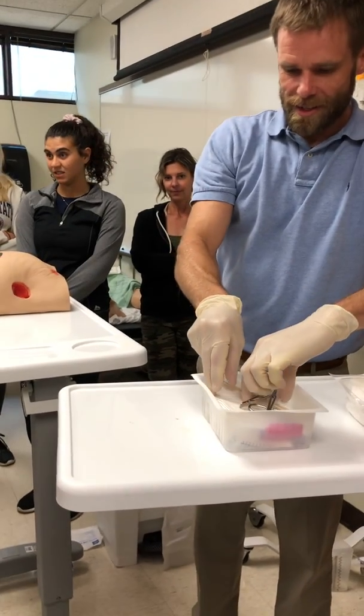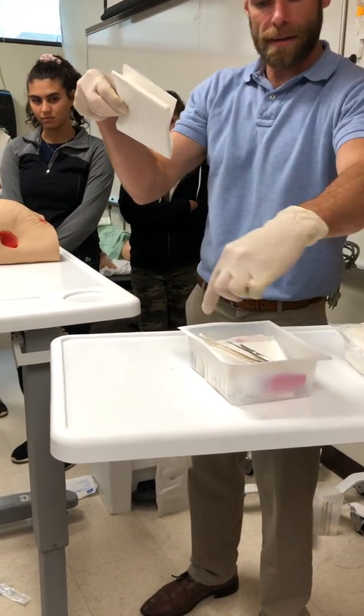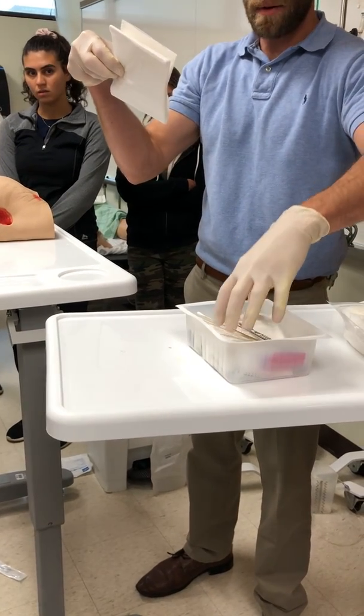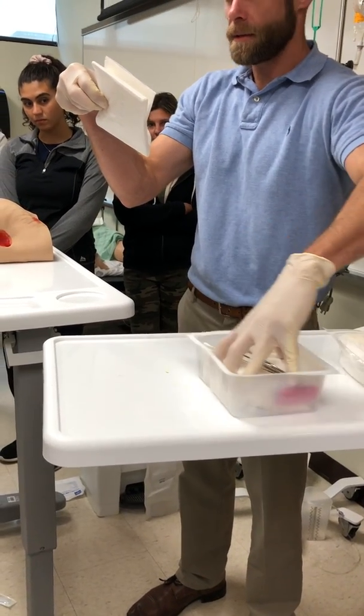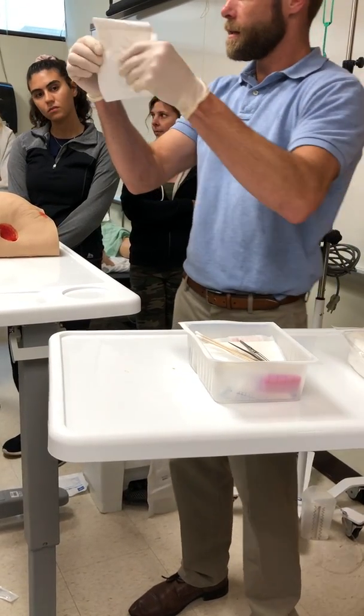So now I can grab stuff inside of here, right? I can't touch that 1-inch border, can I? If I want to move this, how do I move it? I don't get to touch the outside border. I can't touch the outside. You guys okay with that?